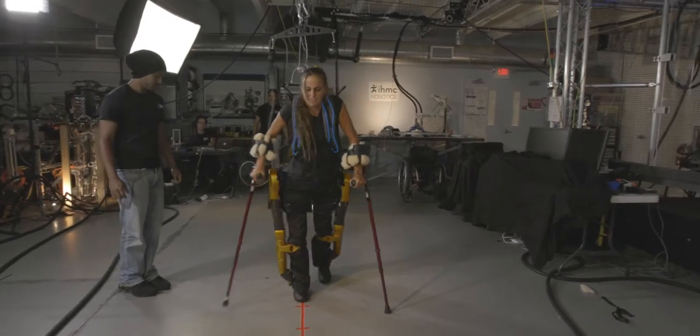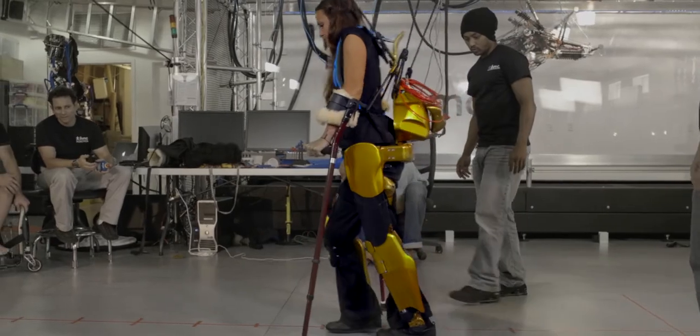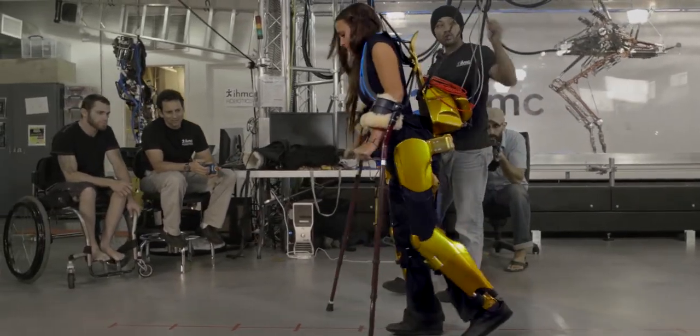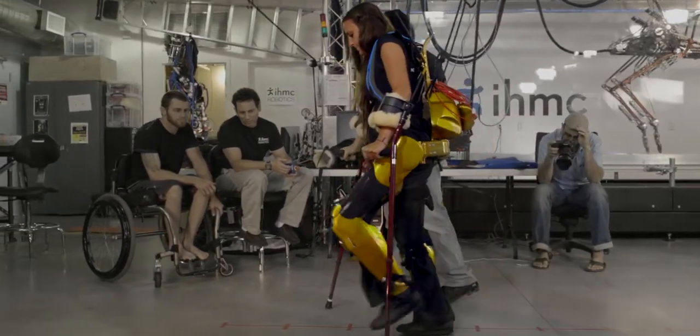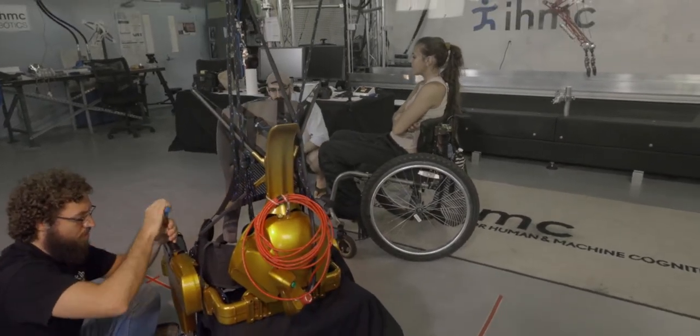It's a more compact device in terms of width, so the user can go through narrow passageways. The device is also more productized in the sense that it doesn't have exposed wires, and it's easier to adjust so that a user can be fitted in about 15 minutes.